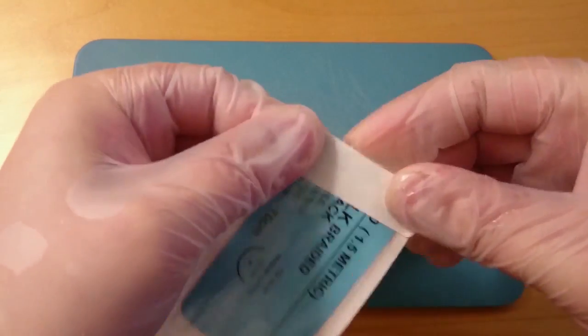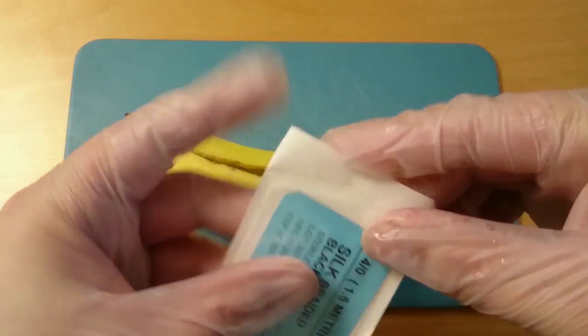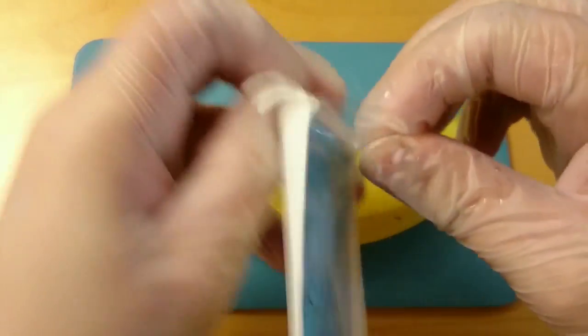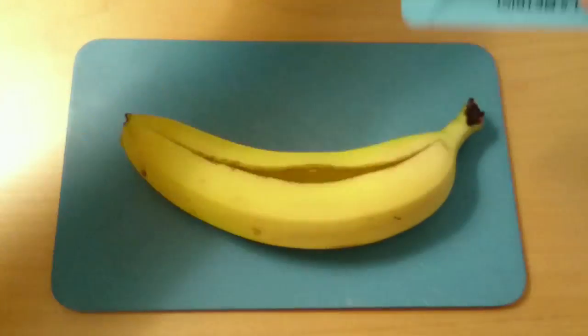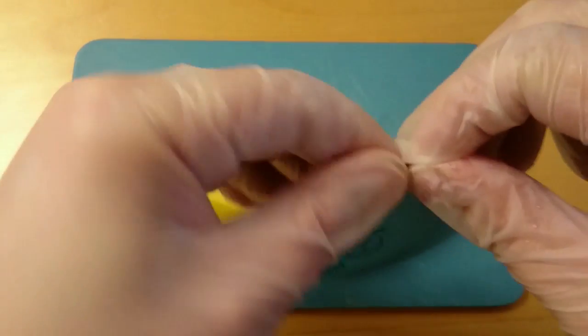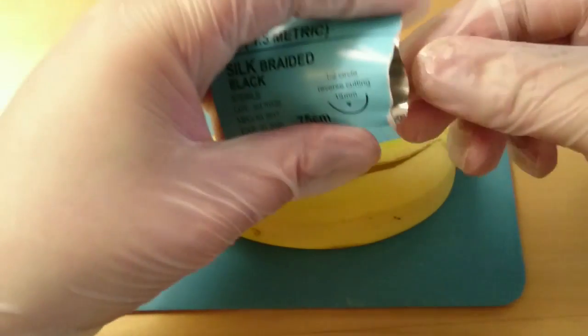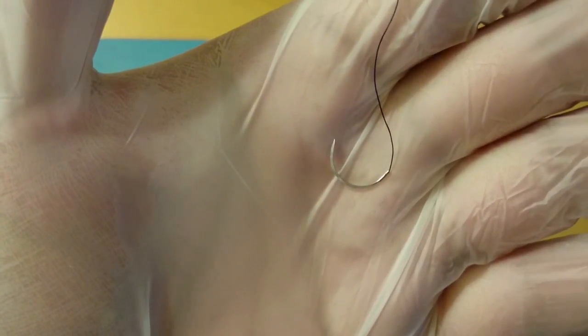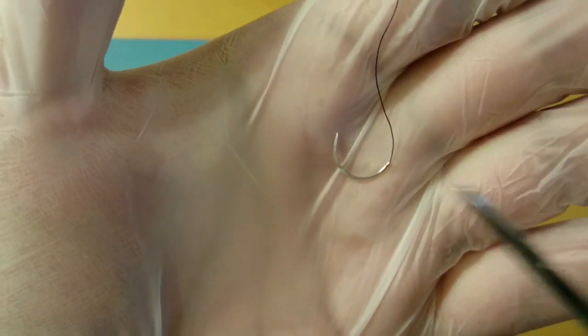Extracting the suture. Never pick up the suture needle from the tip, because you may damage it.